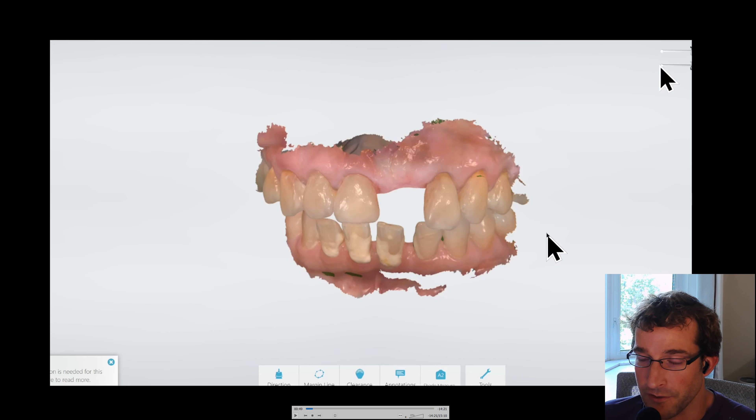So we'll get her in two weeks after the prep appointment and try the unit in. Out of the box from the lab it's too white, so we're going to use Mio — a product I like — to stain anterior teeth to get them a little bit closer to the surrounding teeth. We're basically just going to eyeball the tooth and pick a shade. We use shade A, and I'm going to fast-forward through most of this. We used another one called Clementine for the first application, and there's a liquid you can use to kind of spread it out.